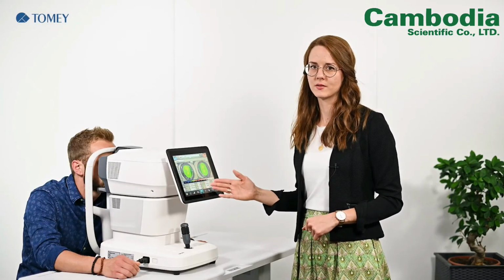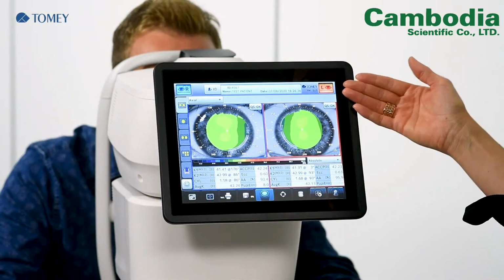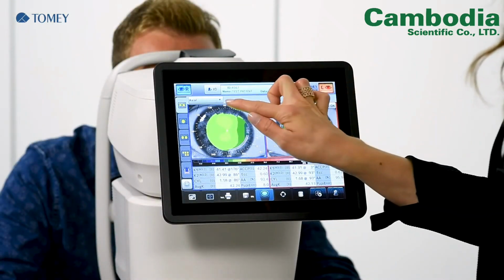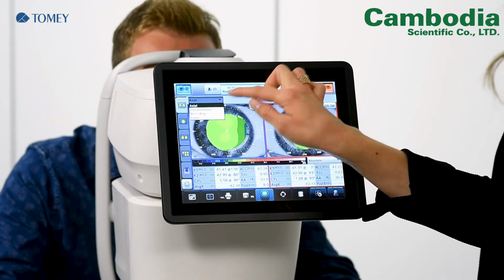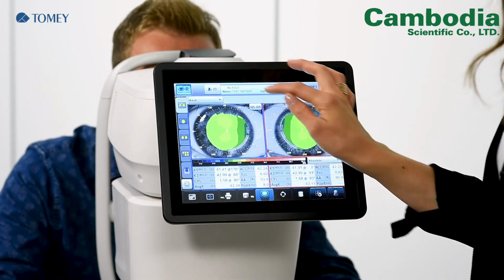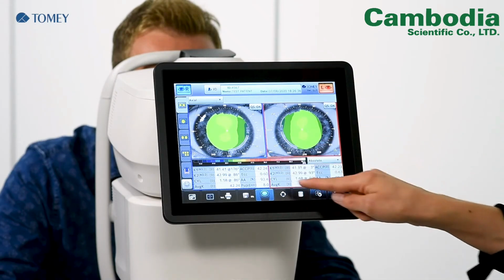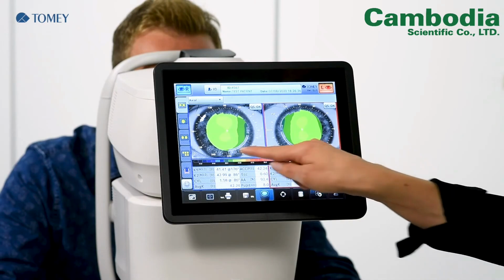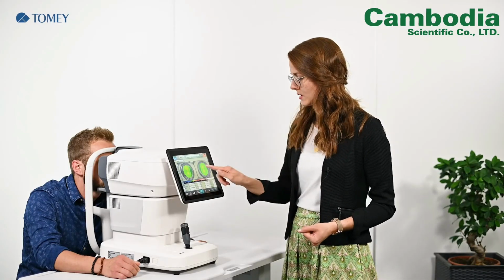So in the first screen of the topography you can see the right eye and the left eye at the same time, and here you have the possibility to choose between the map types, for example axial or instantaneous, and here is also the possibility to have different color scales which you can adjust as you prefer it.